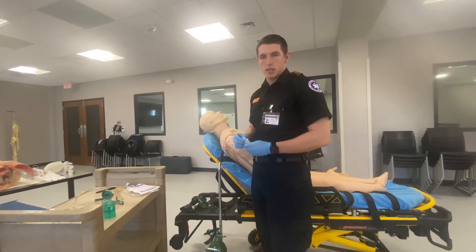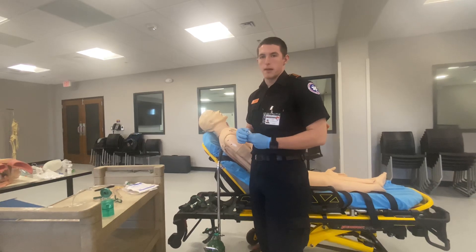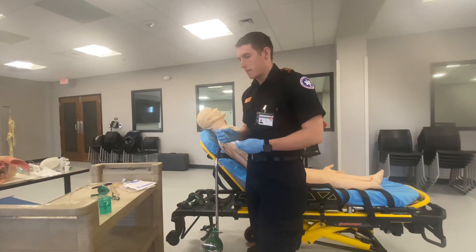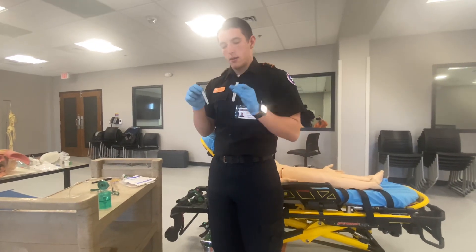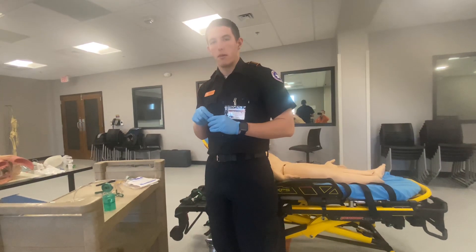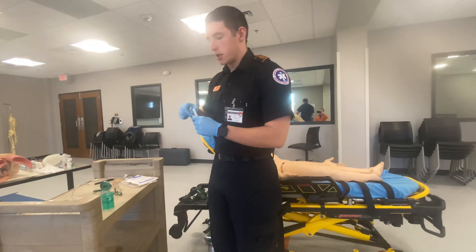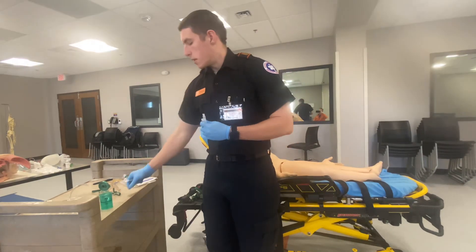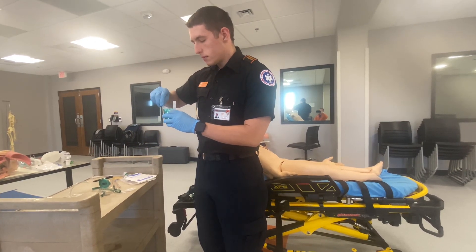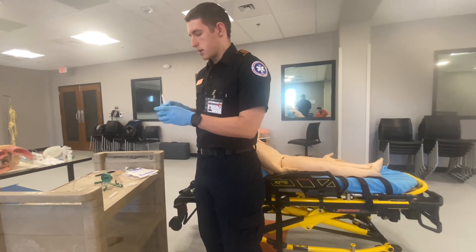This patient is having a suspected asthma attack. So per standard protocols, I'm going to begin 0.5 milligrams of atrovent. I'm going to get two vials of 2.5 milligrams of albuterol in normal saline solution, which adds up to five milligrams of albuterol, and put it inside this cup here.